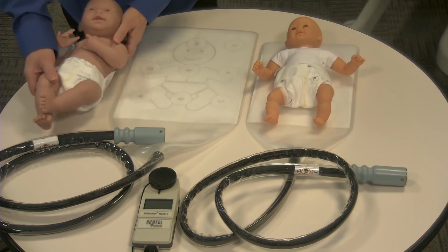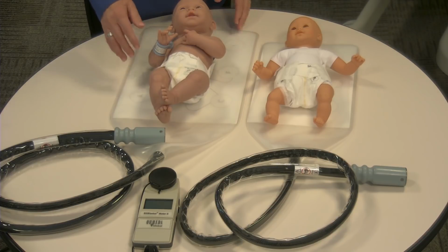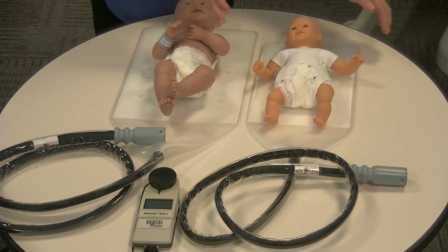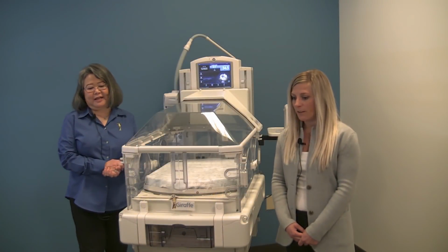The larger baby, who's more like 35, 36 weeks, I would use the larger pad, and you see where the baby's head is positioned, how it covers the body really well, and then you just wrap this. So definitely they get some irradiance on the side as well. So no right or wrong, just your preference. Awesome, thank you. Great description of the pad size.